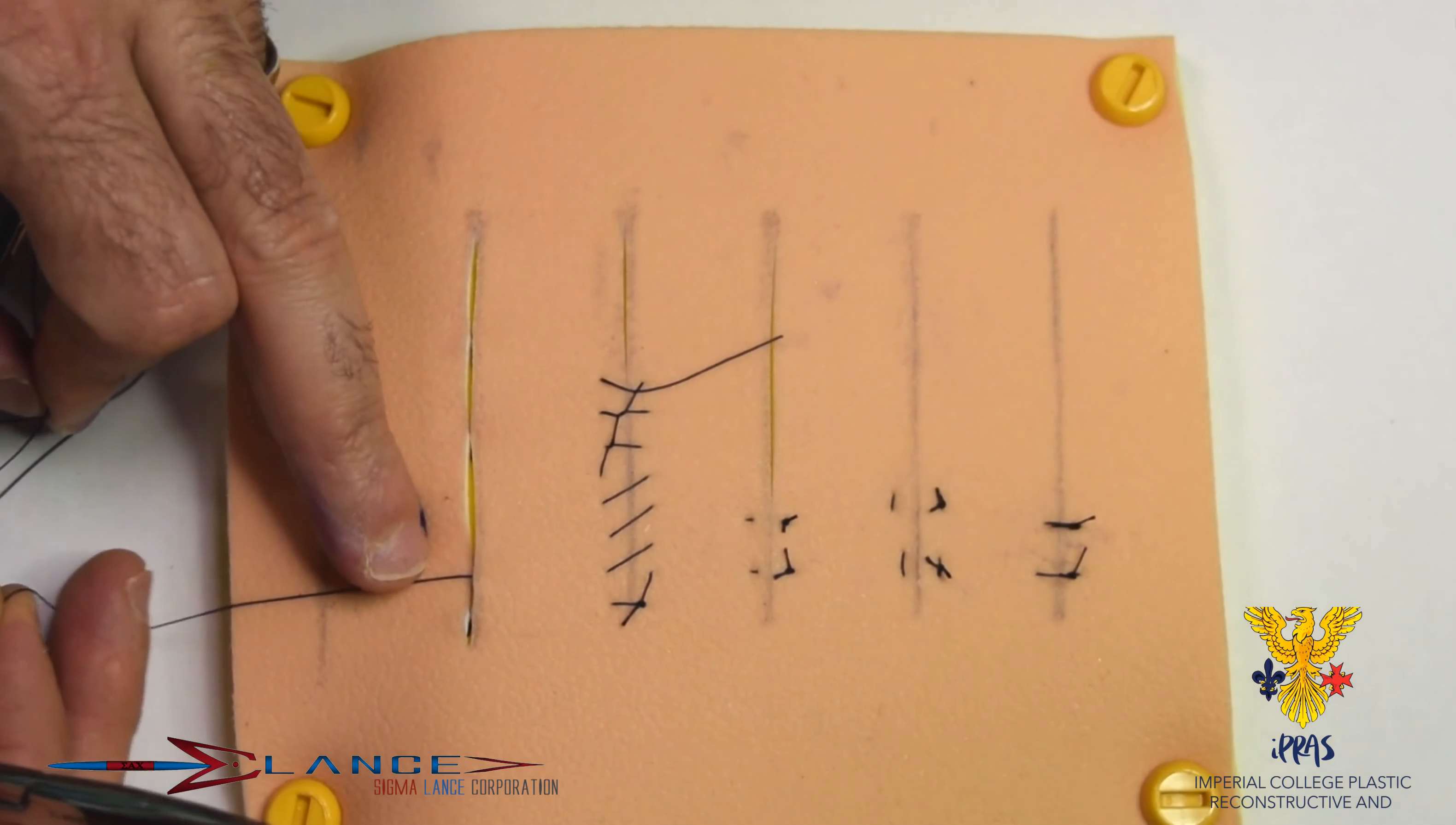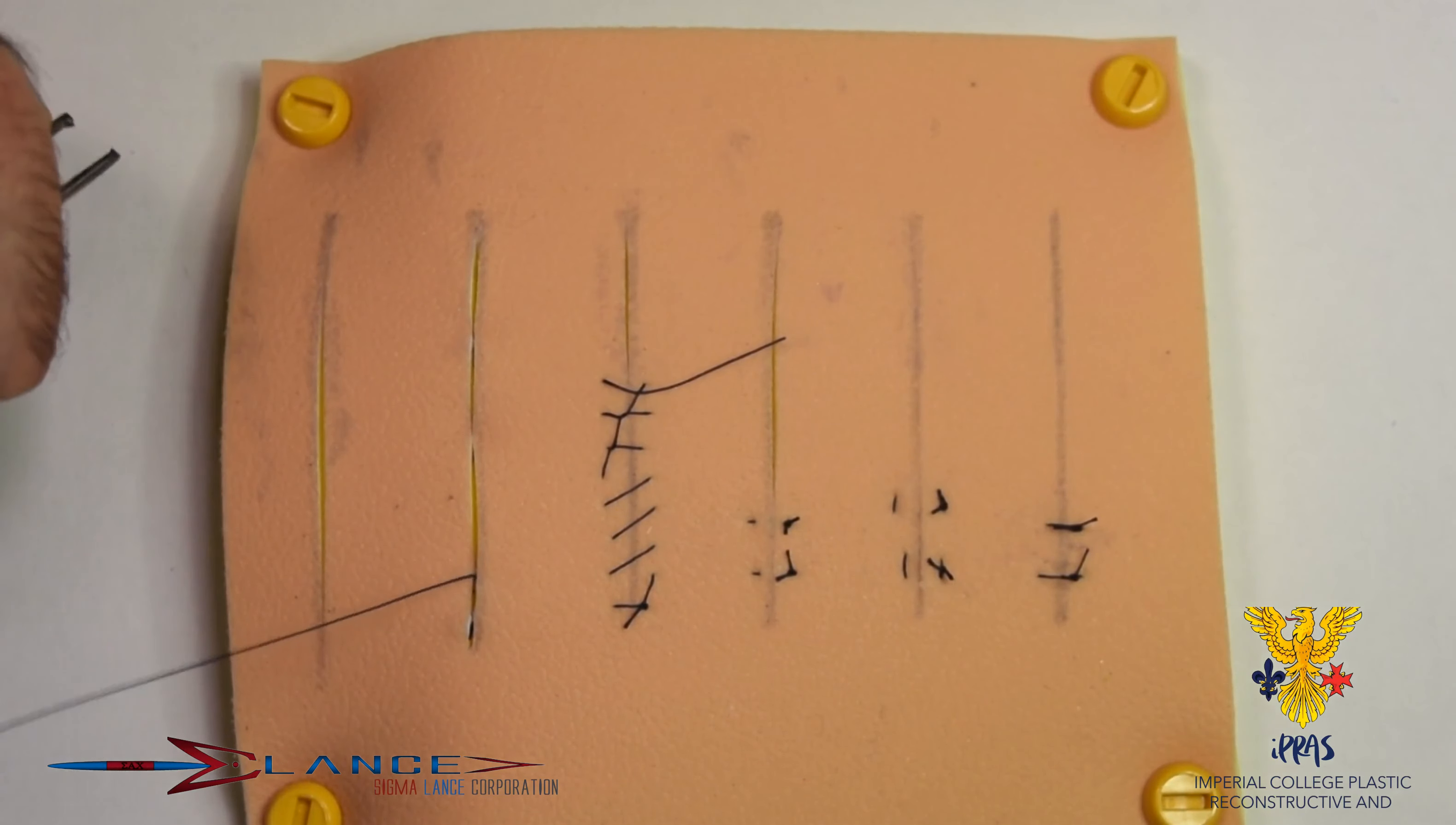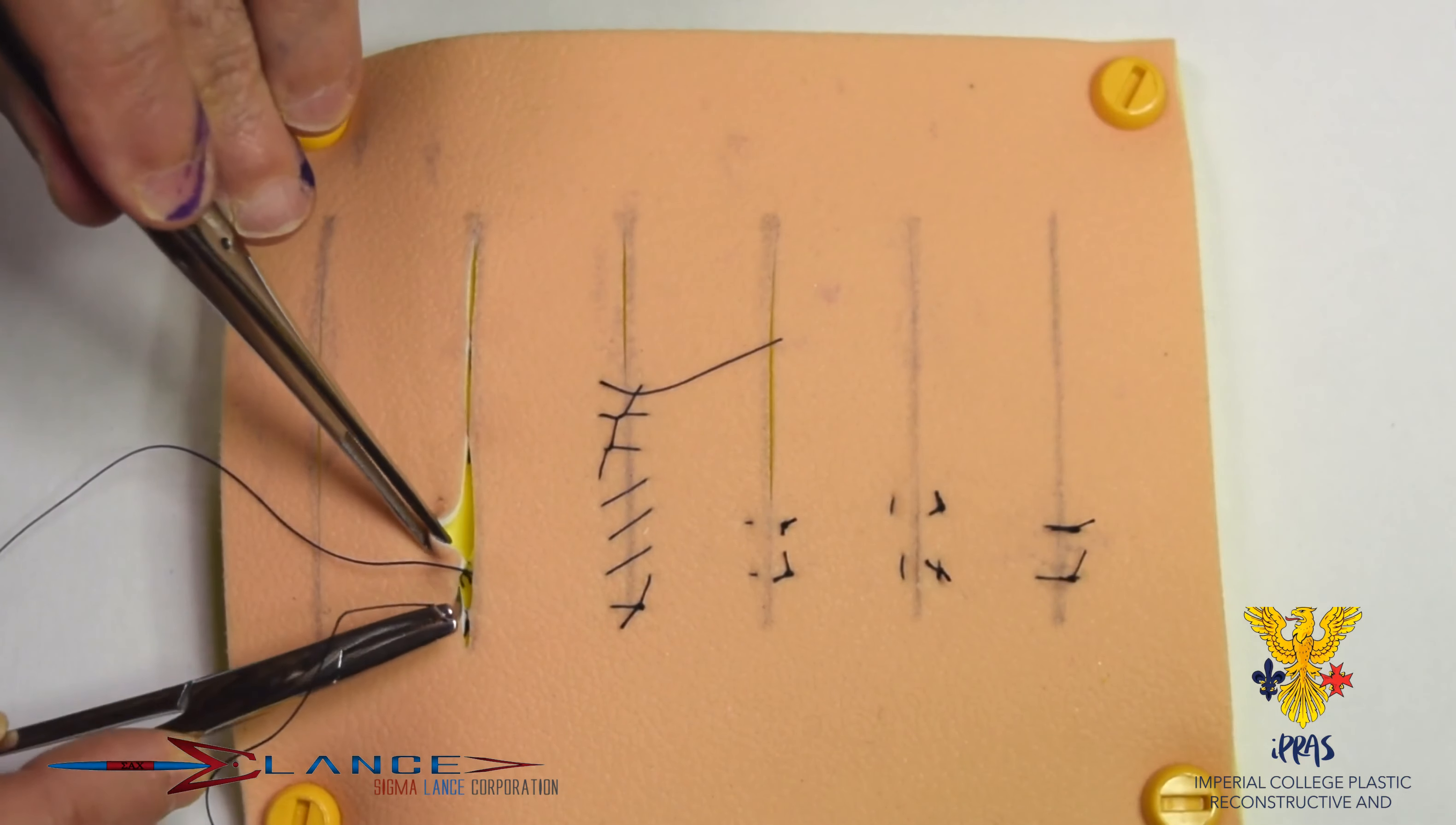And the next bite on my side really should begin just a little bit behind where the suture is sitting. So what we're talking about is that the next bite really should not be here, otherwise the wound won't close. The next bite needs to be behind where that suture is coming out.